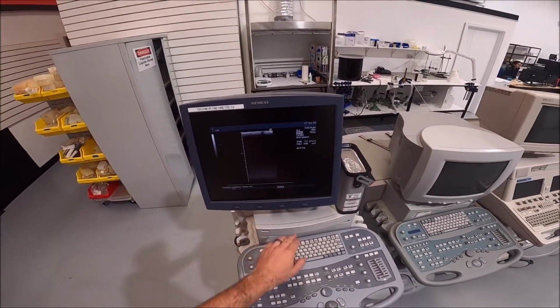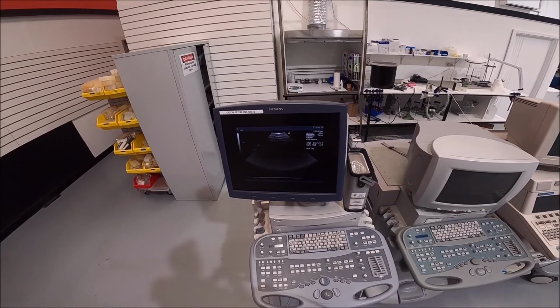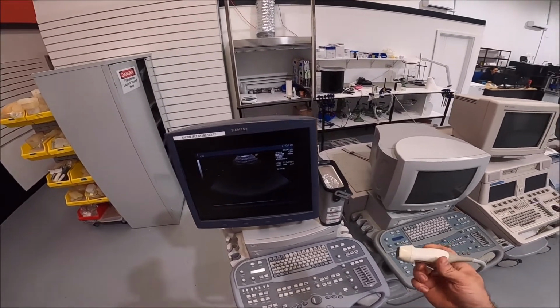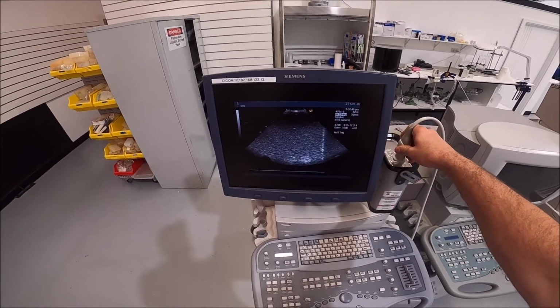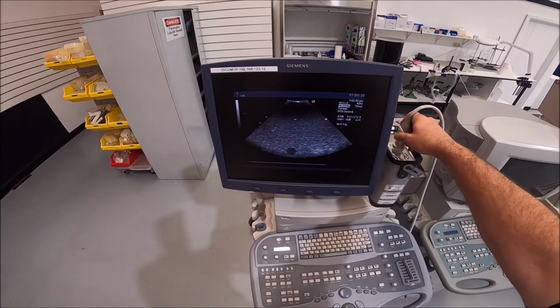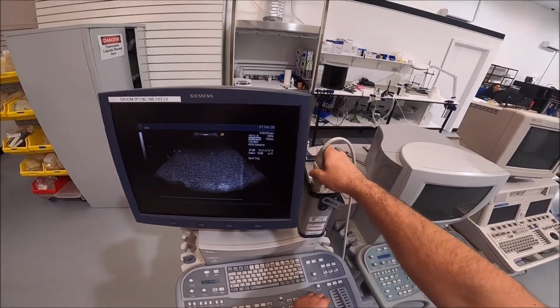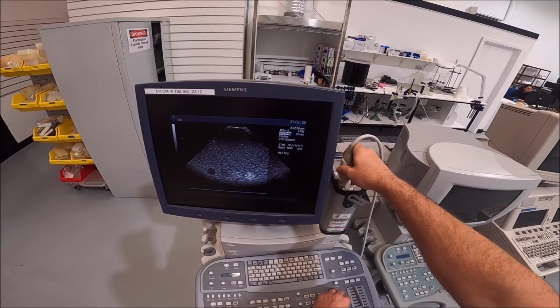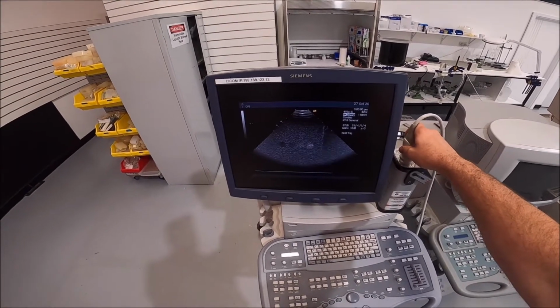So if we switch across to this, right, this probe also has 8 elements down. And that image, I certainly cannot see where those 8 elements are down because it's a phased array probe. So the only real way of testing it is to do a full acoustic test. And the problem is you think, well, if I can't see that they're down, it obviously doesn't matter, who cares?